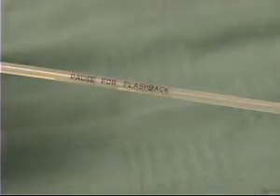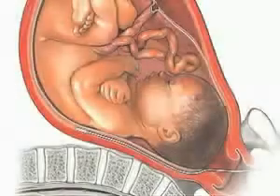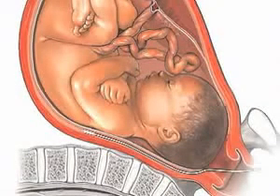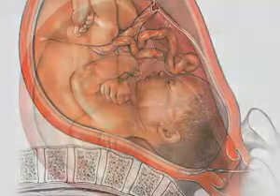Insert the Koala up to the "Pause for flashback" marking, and then watch for amniotic fluid flowing back through the clear lumen. If the catheter is placed extraovular, a flashback of frank red blood, more distinct than blood-tinged amniotic fluid, may be observed. Remove the catheter and carefully replace it in another quadrant, pausing for amniotic fluid flashback as before.